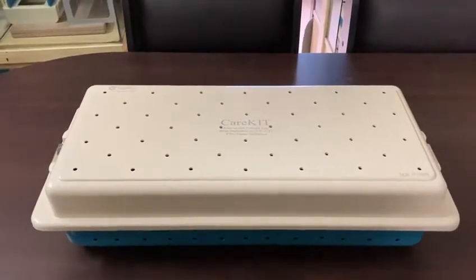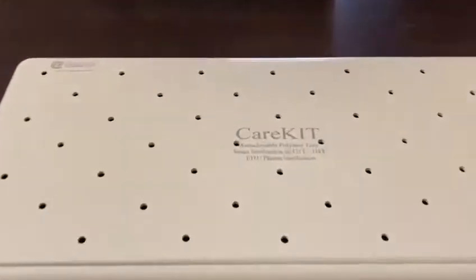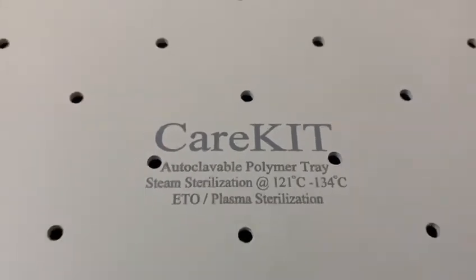This is a laparoscope instrument tray from Endosys, for all your sterilization needs. You can do autoclave, ETO, and plasma sterilization.